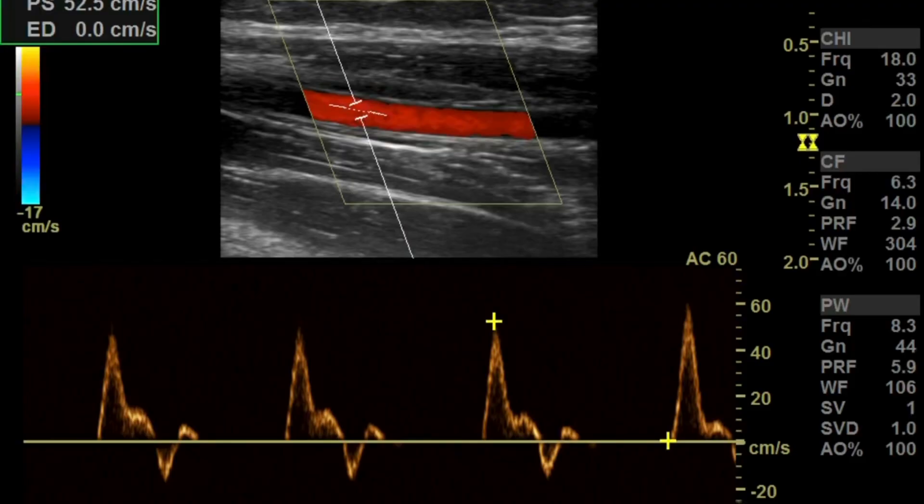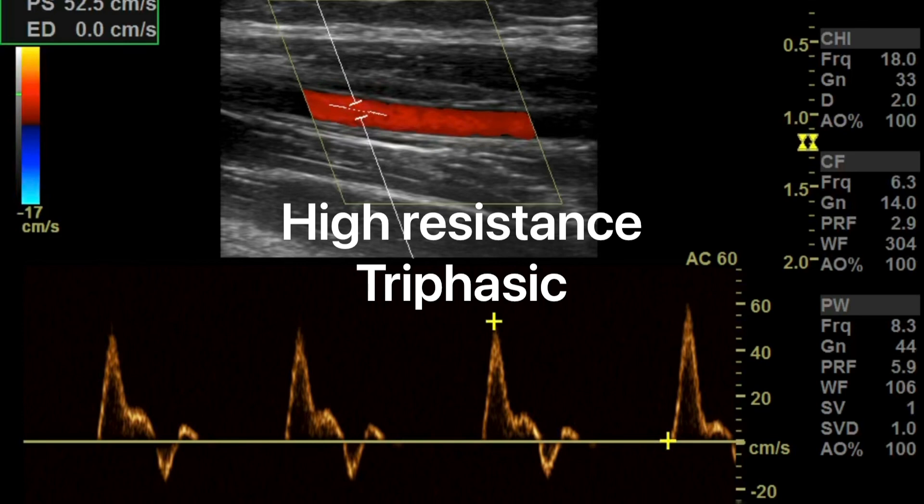Waveforms in these grafts and fistulas are going to differ from your typical waveform in the upper extremity. The normal waveform in an upper extremity artery, like the radial artery, is triphasic in nature, with a clear spectral window.